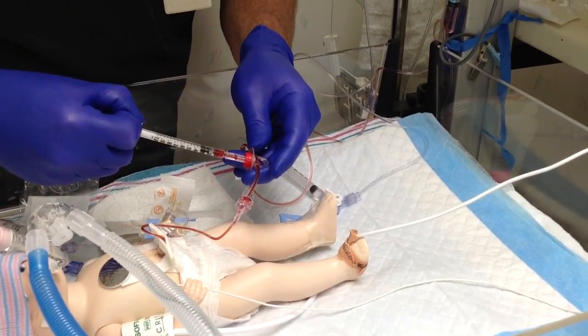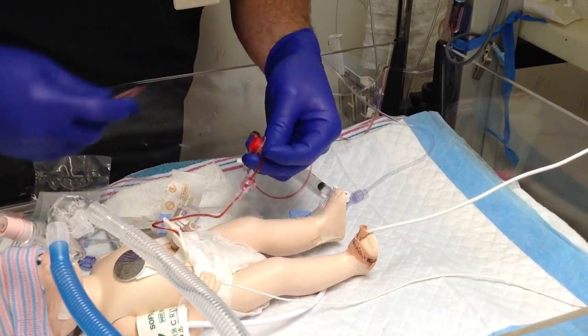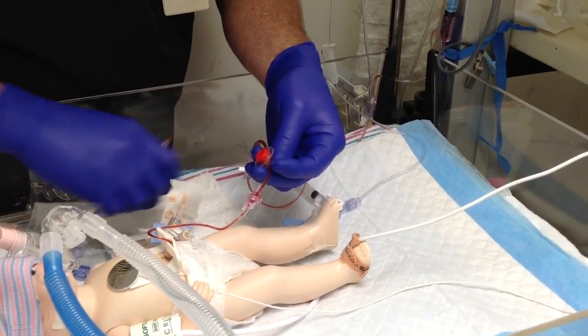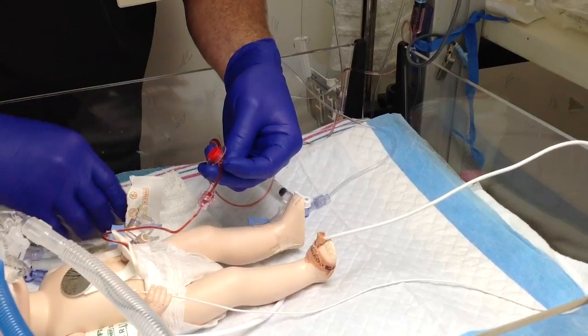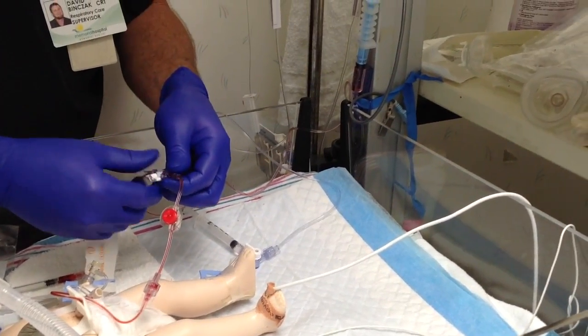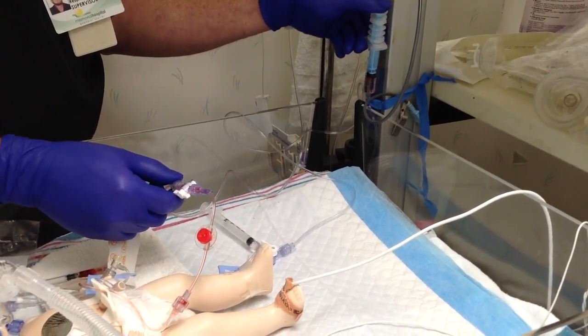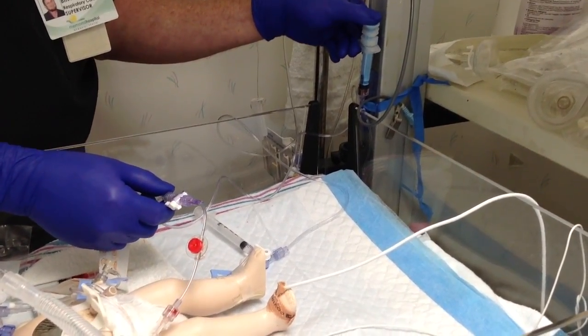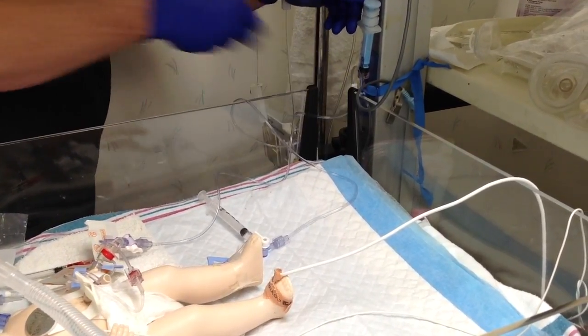You may want to ask your nurse if she needs labs. Recap your needle with safety precautions — safety first. Open your stopcock back up and pulsate your flush syringe several times to clear the line so no blood is left in the line. You then want to turn your stopcock back up.